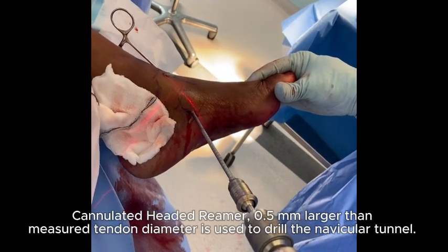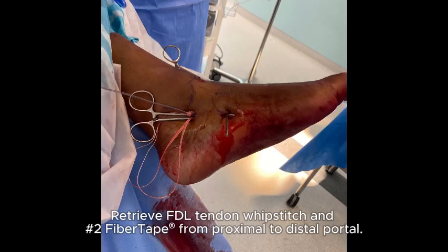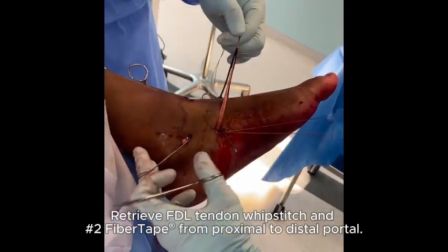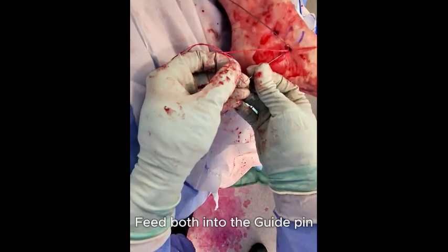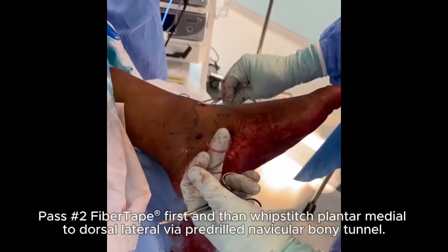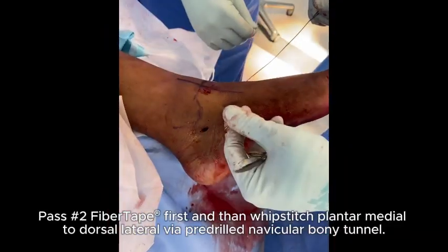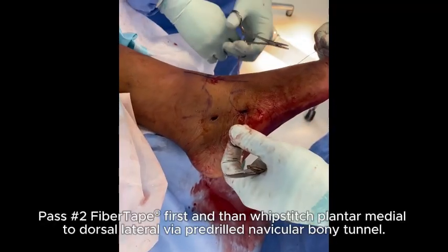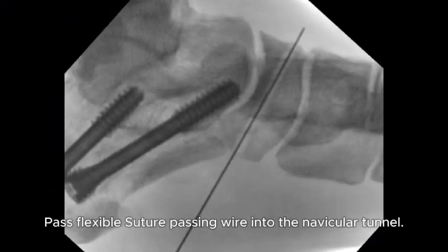Cannulated headed reamer 0.5 mm larger than measured tendon diameter is used to drill the navicular tunnel. Retrieve FDL tendon whip stitch and number 2 fiber tape from proximal to distal portal. Feed both into the guide pin. Pass number 2 fiber tape first and then whip stitch plantar medial to dorsal lateral via pre-drilled navicular bony tunnel. Pass flexible suture passing wire into the navicular tunnel.